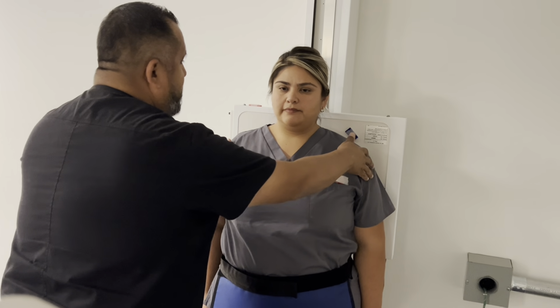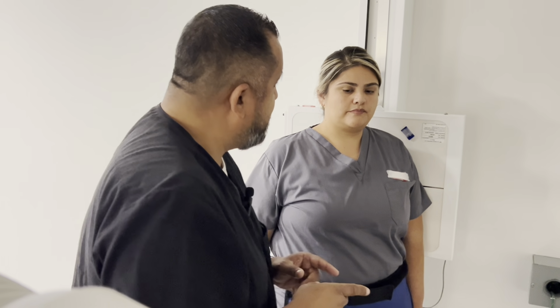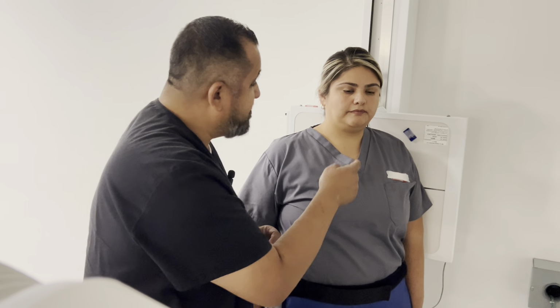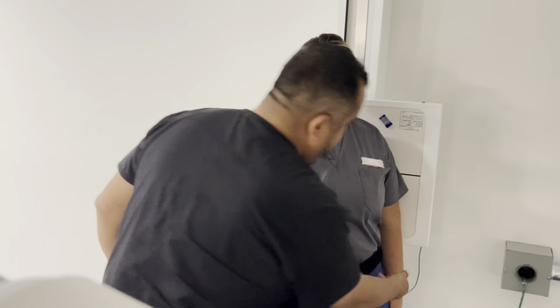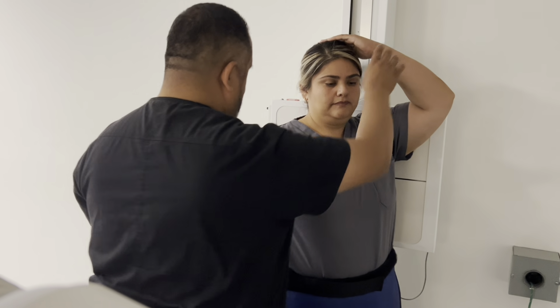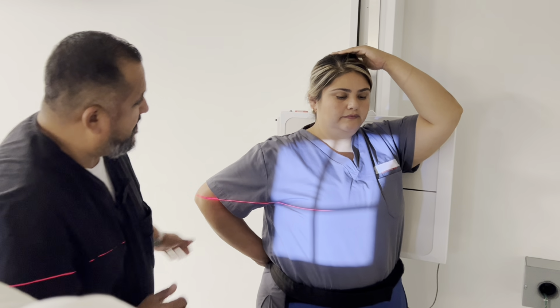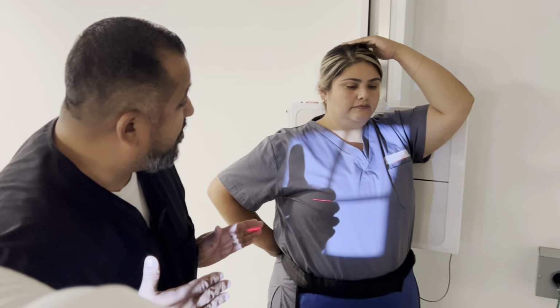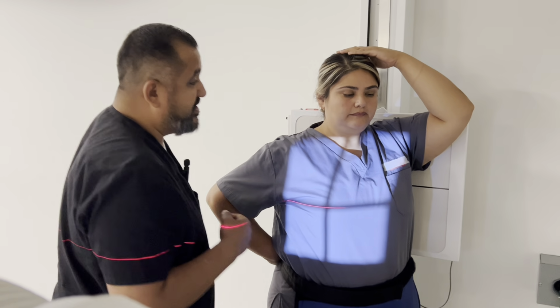All right. So we're going to turn here at a 45-degree angle, just like that. There you go. And remember, I said the side of interest, that's the arm that has to be elevated. So if we're doing an LPO, it's the side closest to the IR, right? So post is close, A is away. Remember that for your obliques. So now we're going to raise this arm up. You're going to bring this arm back just like that. There we go. So we're going to go through this elevated side to get to the side that's down, the side that's closest.